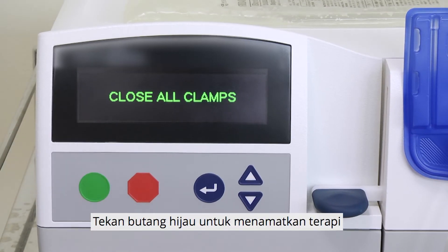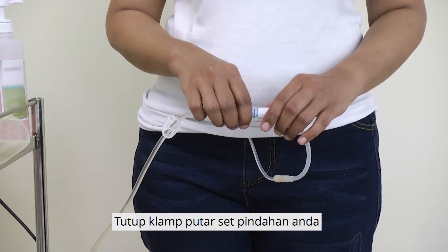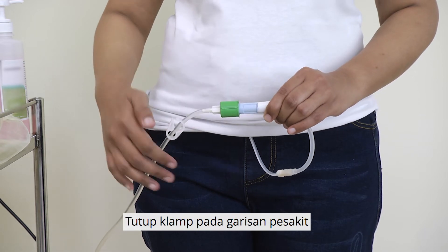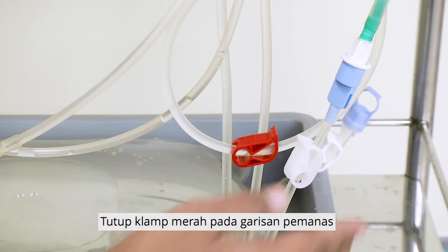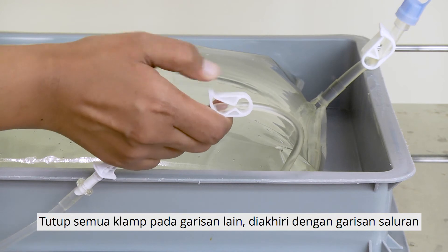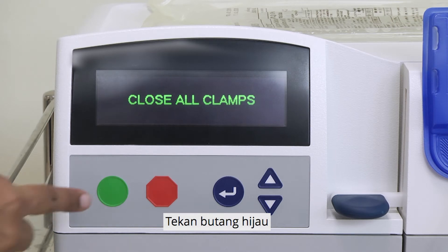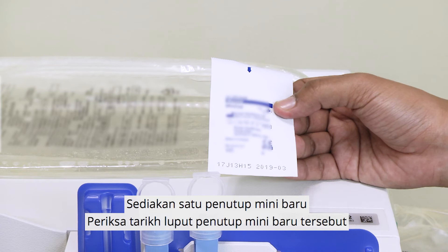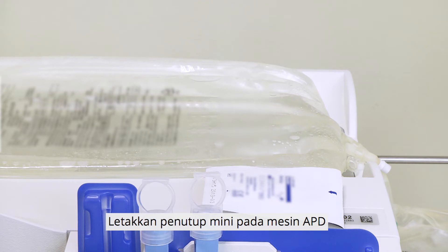Press the green button to end the therapy. The screen will show 'Close all clamps.' Close the twist clamp of your transfer set. Close the clamp on the patient line. Close the red clamp on the heater line. Close all the clamps on the other lines, ending with the drain line. Press the green button. The screen will show 'Close all clamps. Disconnect yourself.' Prepare a new mini-cap, check its expiry date, and place it on the APD machine.